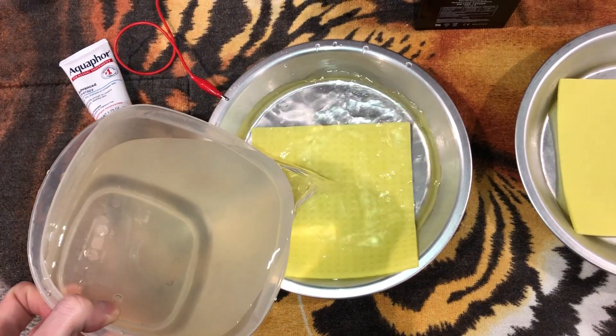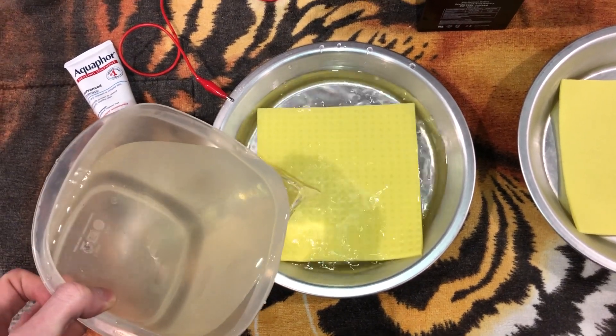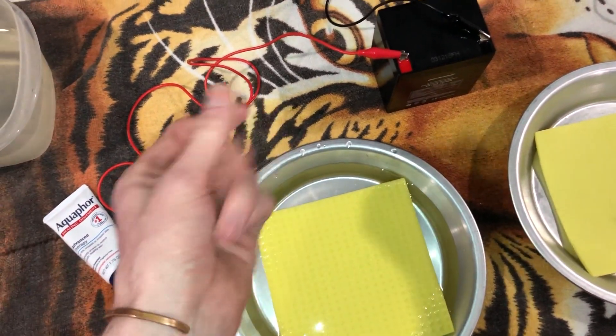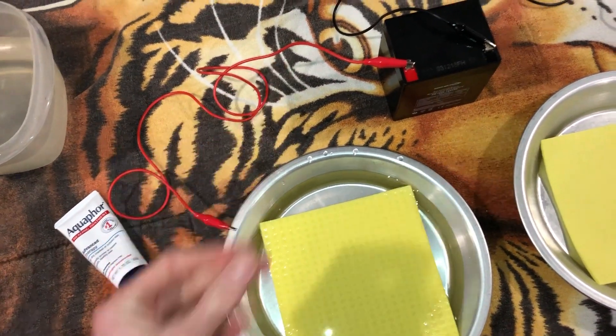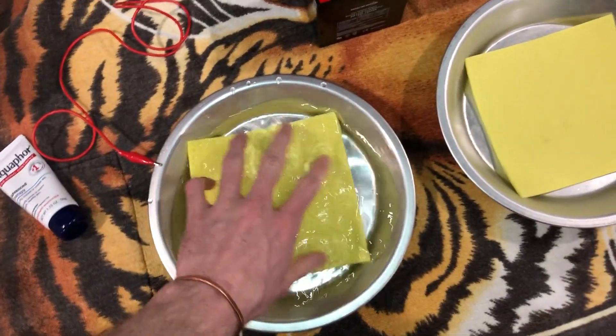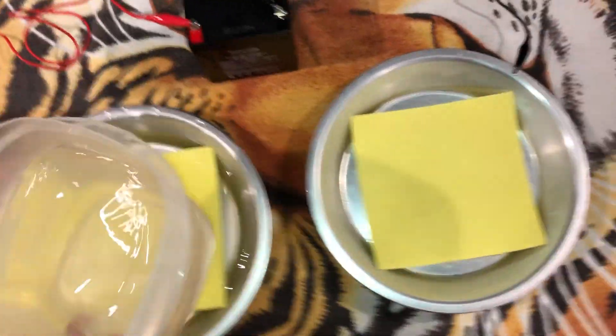Then you're gonna want to fill it with water. It's kind of up to you on how much water you want to put in — you just need your palms covered. The surface of your fingers doesn't need to be completely submerged.